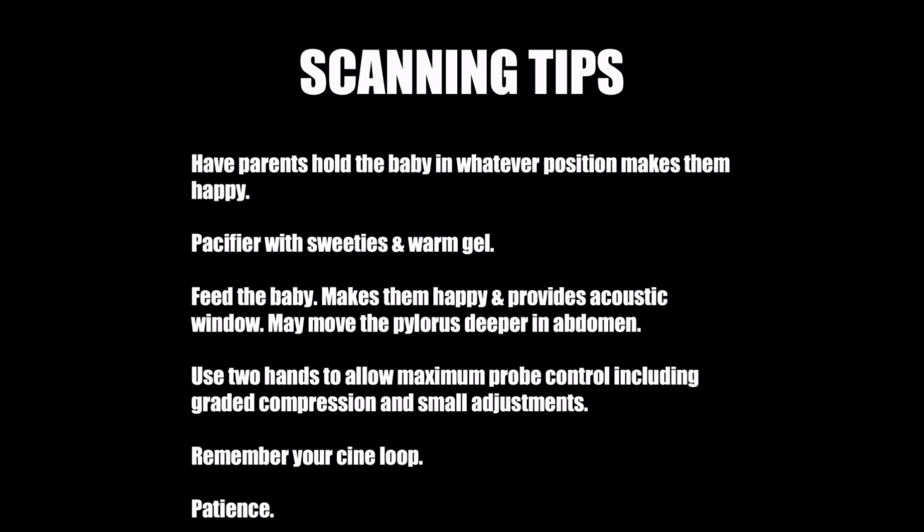Try feeding the baby before you do your scan. This will accomplish a couple of different things. First, it makes the kid happy. It also tends to provide you with a better acoustic window. You're going to fill that stomach now with fluid as opposed to the air that they've got entrained from screaming.